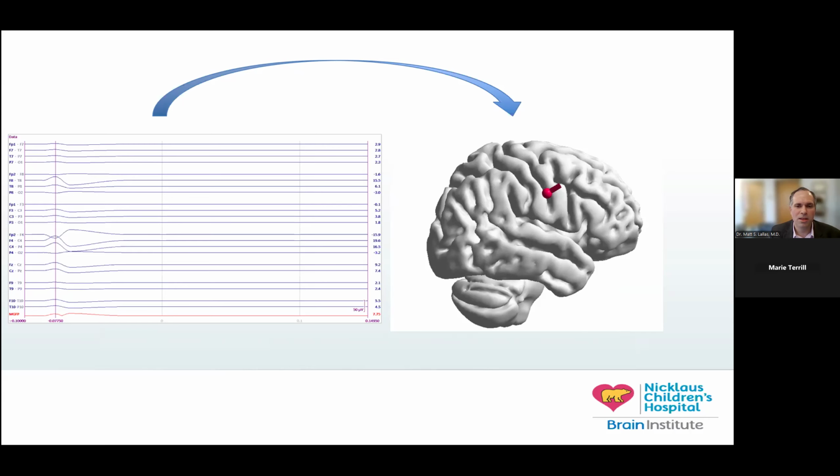In general, the reverse is much easier, where we know where the current is coming from, and if we have the current and the brain and the conductivities and all those things, predicting the EEG should be relatively simple for the computer, and there should be essentially an answer to that. That allows us to get some idea of the quality of our responses, but what we're trying to do on a day-to-day basis is the more difficult response.